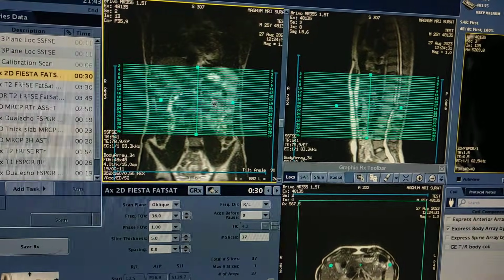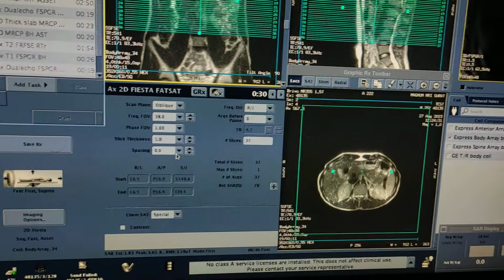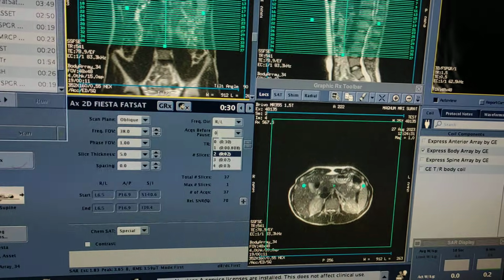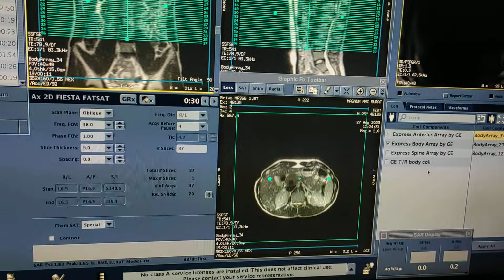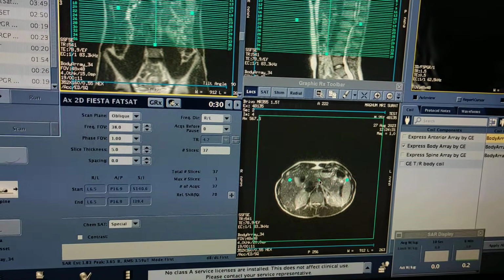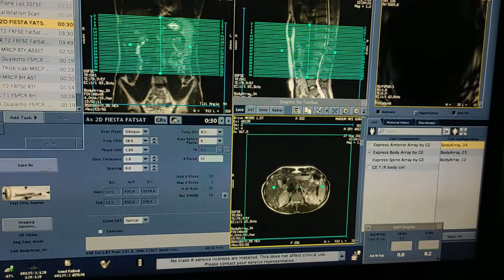So you have to cover this liver area. Thickness is 5 and spacing is 0. This is a breath hold sequence. From here you can take breath hold and ask the patient to hold the breath. But at present I am just localizing the images, so I am not asking the patient to hold the breath.